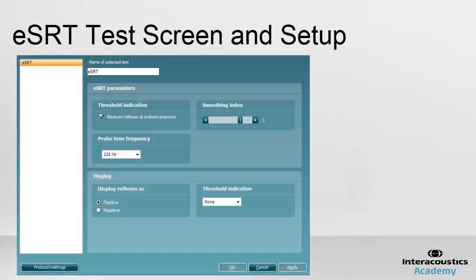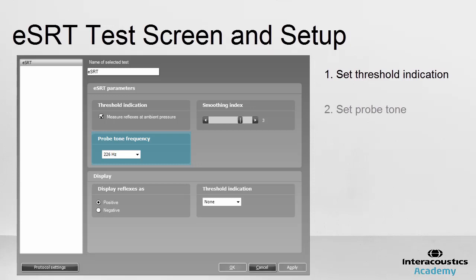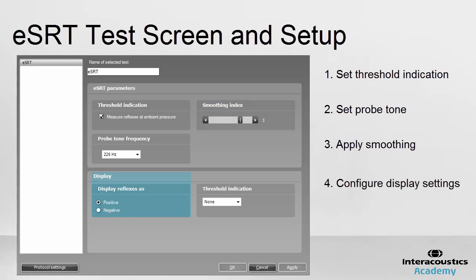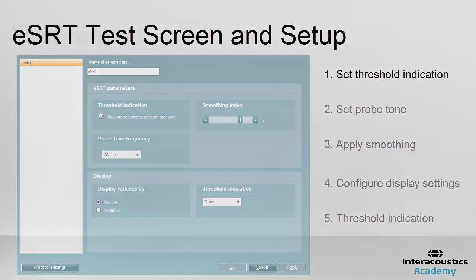From the Titan ESRT setup, it is possible to set the threshold indication to be obtained at ambient or peak middle ear pressure. The probe tone can be set for the four different probe tone frequencies described previously. Smoothing can be applied to remove noise from the trace. From the display settings, the reflex can be set to a positive or negative deflection, and the threshold indication line providing the visual target of when a reflex is present can be changed.